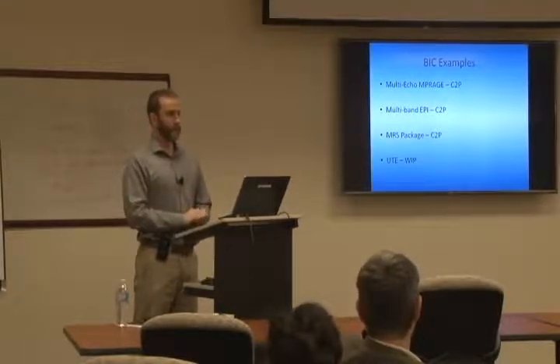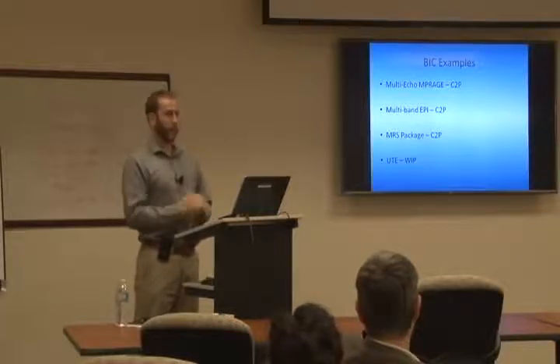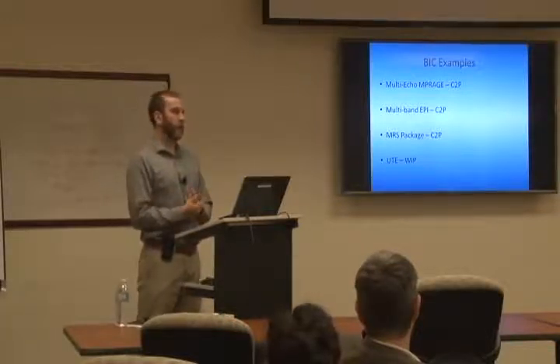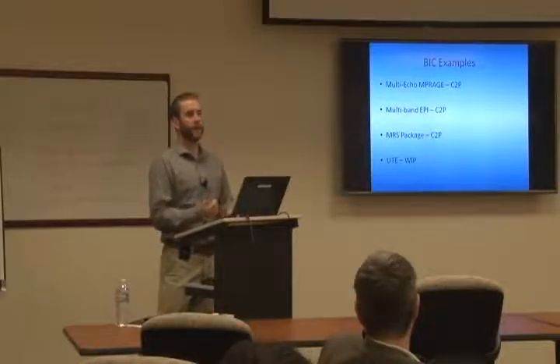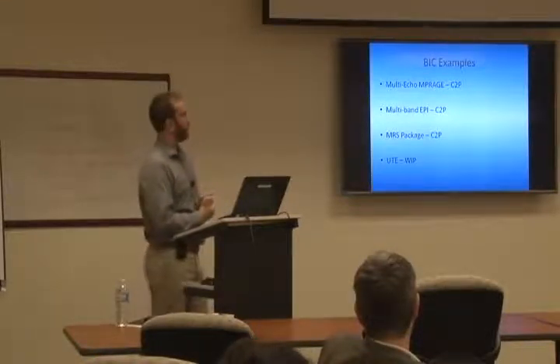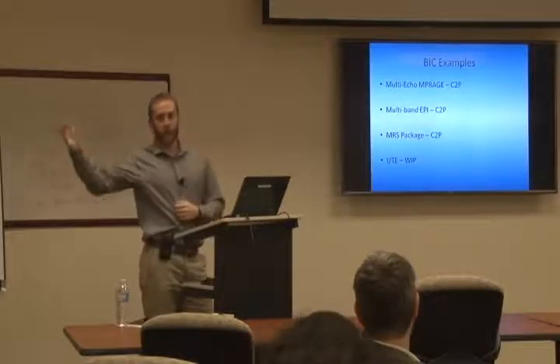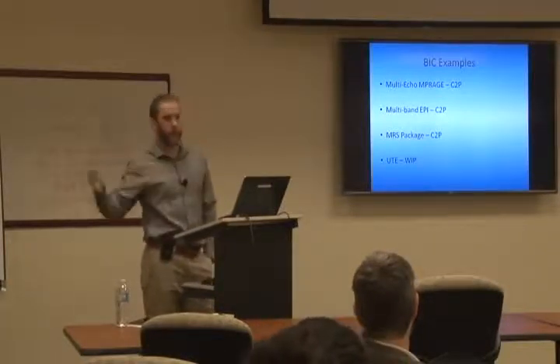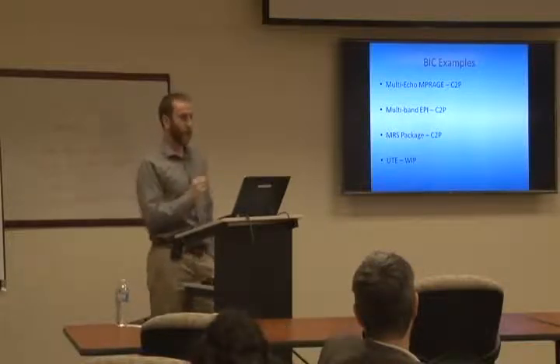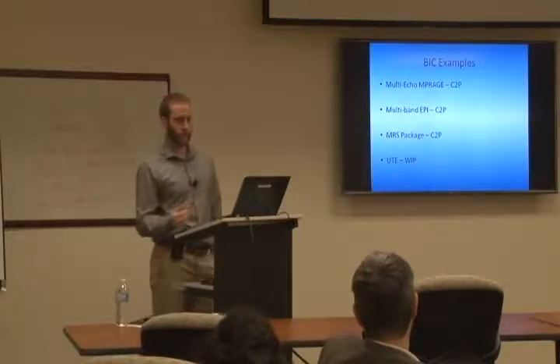And that's having a direct effect on your repetition time. So if you're doing an fMRI resting state scan, and you want to map out the time course, you are getting more points per unit of time because you can get a lower repetition time using the multiband EPI.